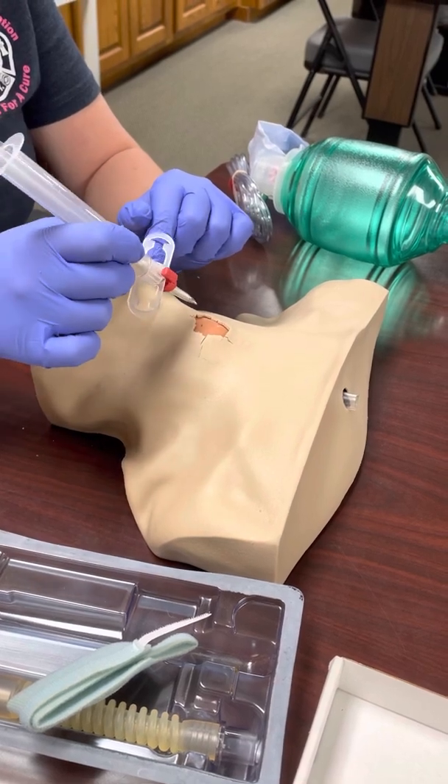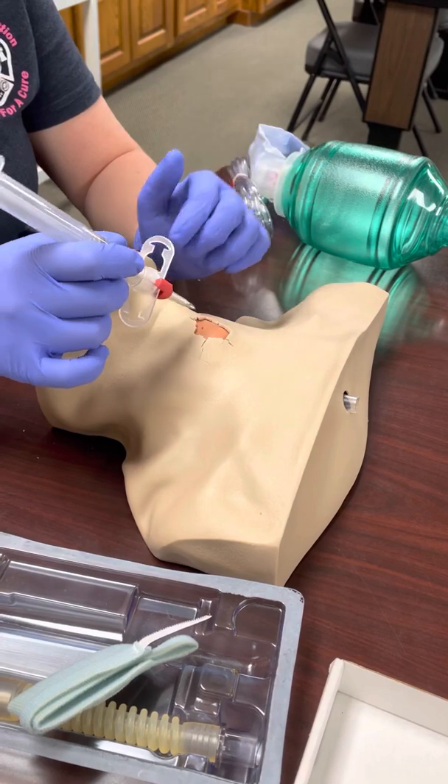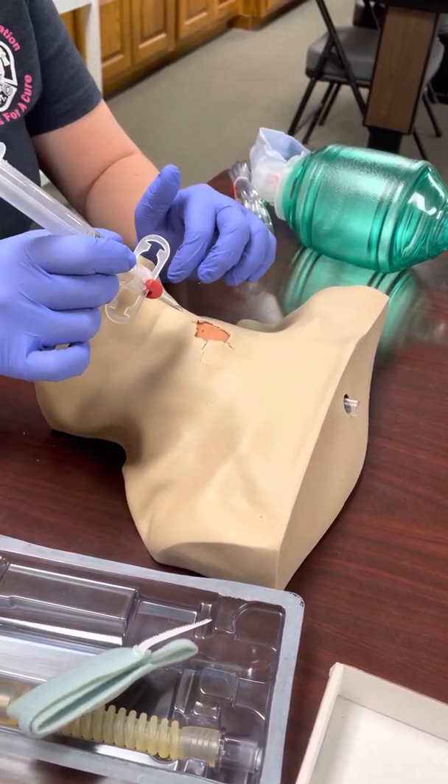I think of it as cannulating a trachea just like you would with an IV into a vein. You want to follow that natural curve into the trachea so you don't poke through to the esophagus.